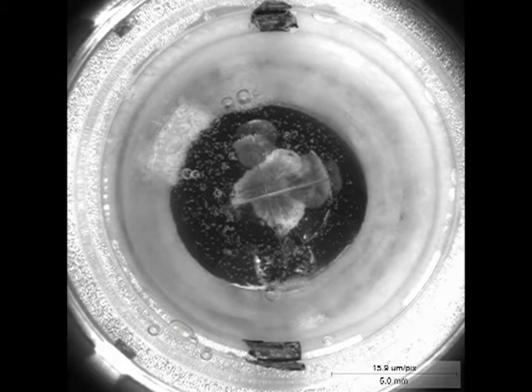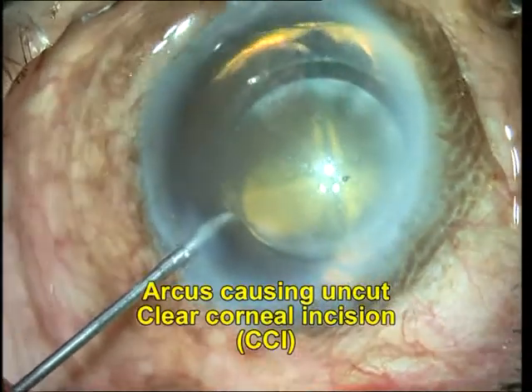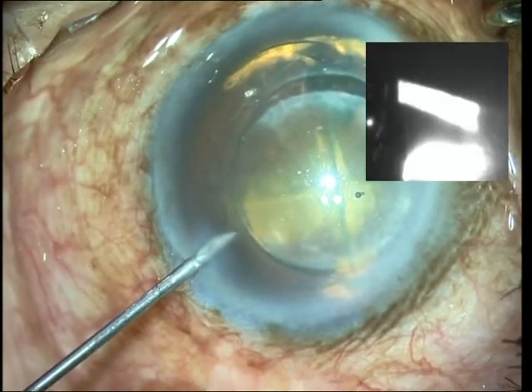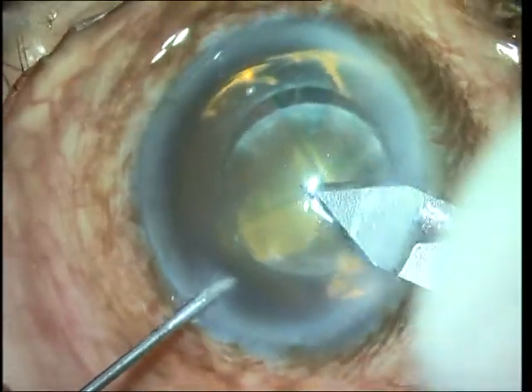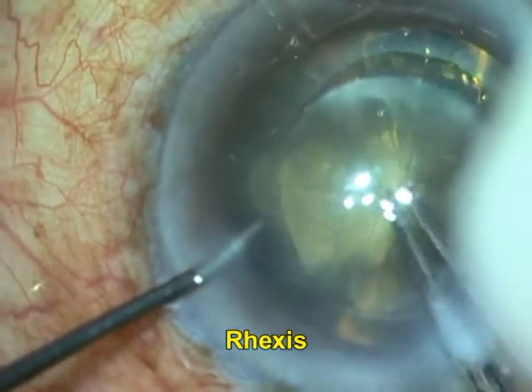This is followed by construction of the main port and the side port. In this case you can see an incompletely dissected main port with the femtosecond laser, because the corneal arcus interfered with the identification of the limbus. We finally go back to creating the incision with the keratome manually and then continue with surgery as usual.